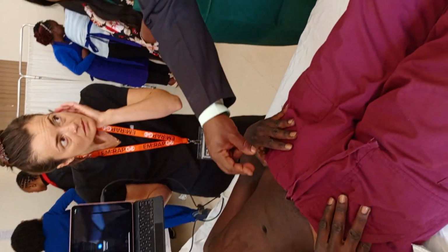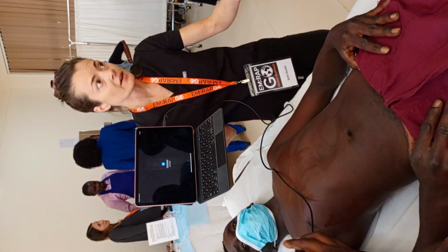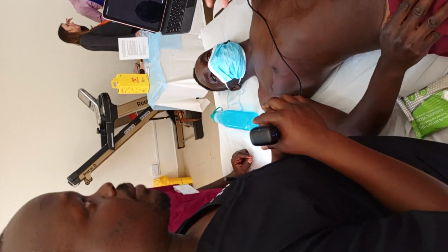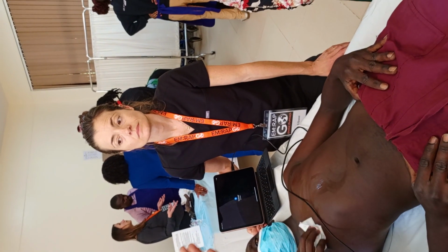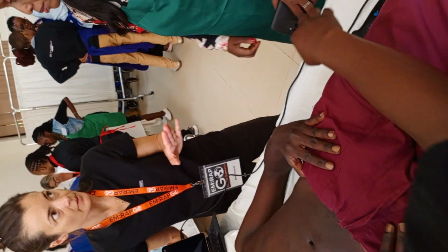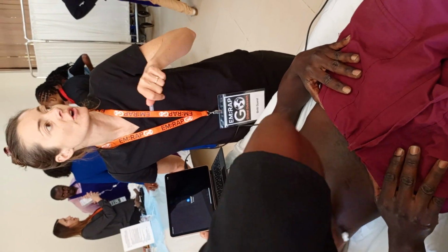When we are looking at the suprapubic region, there are three structures we are interested in: the bladder, the rectum, and the prostate. Not in a FAST. In a FAST, we don't worry too much about that in a trauma setting. I just want to know, is there free fluid? But maybe you can speak to more internal medicine. For FAST, just looking for free fluid outside the bladder. For other abdominal ultrasound, your interest is the prostate, the ureters, and all that. But for FAST, just free fluid. I'm not even trying to find the rectum or the prostate. I want to do quick, can I see free fluid in this abdomen? Does this patient need to go to the operating room now?